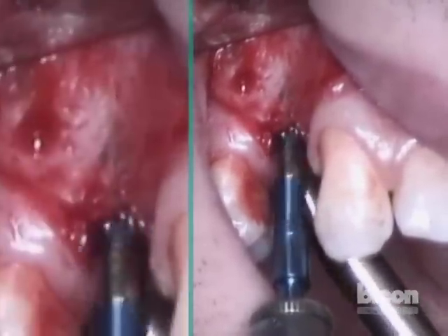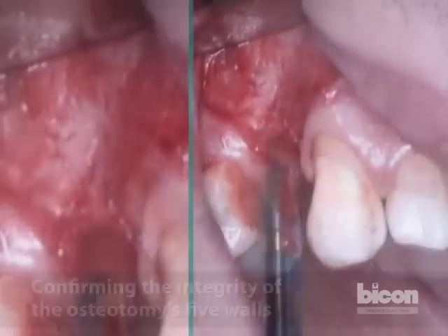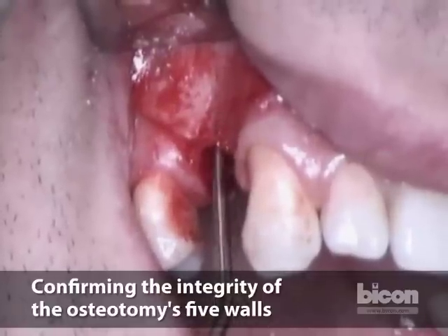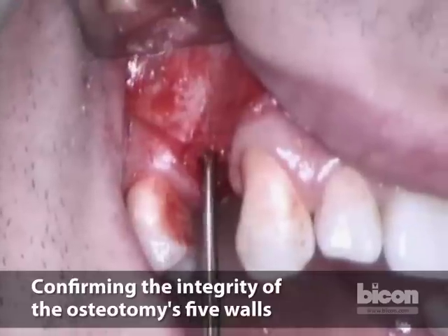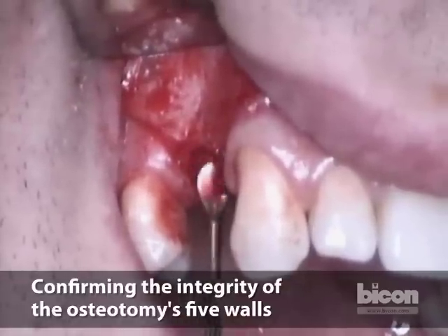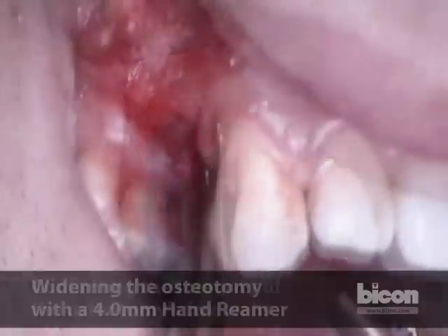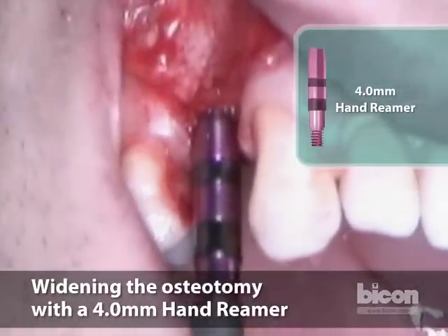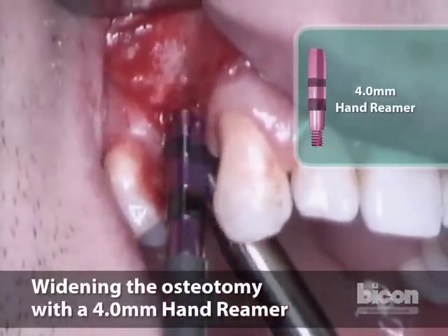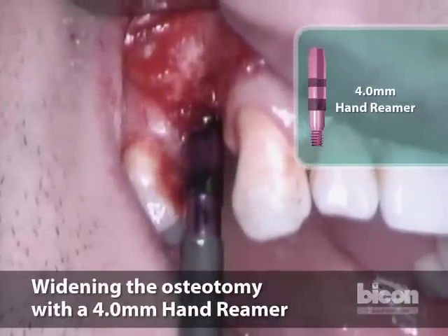If you look closely, you see that the bone, although still existent facially, is so thin as to be translucent. Before I continue, I will make sure that we do have a sinus floor — and we do — and that we are weak only in the buccal, not the palatal. I would rather graft only the buccal. The palatal tissues are very hard to maneuver around, so we will favor the palatal and keep it thicker. If we dehisce through any portion, it would be through the buccal. When you introduce the instrument, if you twist a lot, you cut a lot; if you push a lot, you expand more than cut. We don't have a lot to expand, so I am going to try to ream it. If the bone splinters, it's okay — we will graft it.